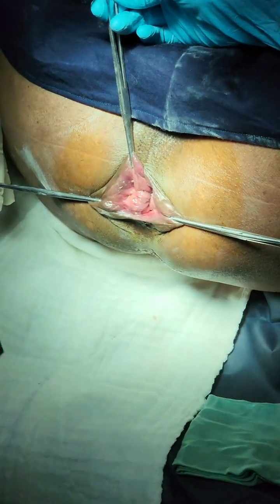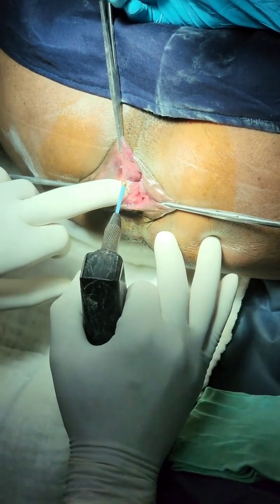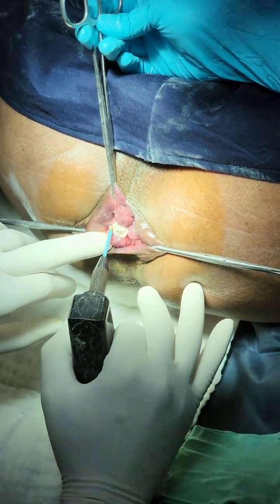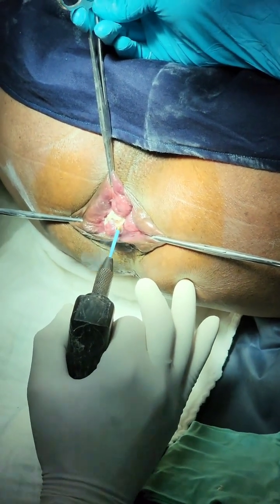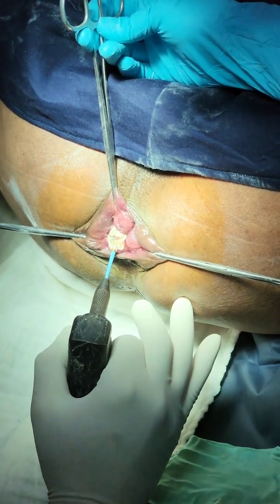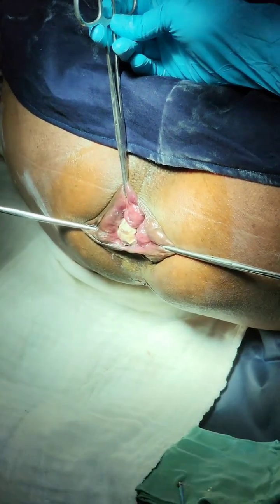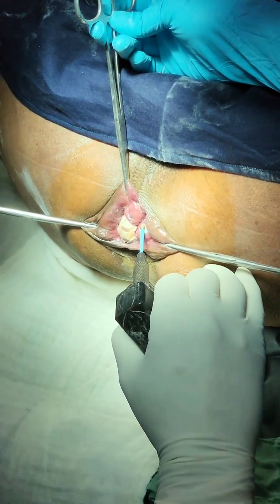This is a case of grade 3 hemorrhoidal disease. With better understanding about the hemorrhoidal cushion, which helps in anal continence, their preservation is the new way to look at the treatment of such hemorrhoids. We describe a technique of radio frequency ablation of the hemorrhoid followed by mucopexy to treat grade 3 hemorrhoidal disease, which we term as radio frequency ablation and mucopexy of the hemorrhoid under vision.